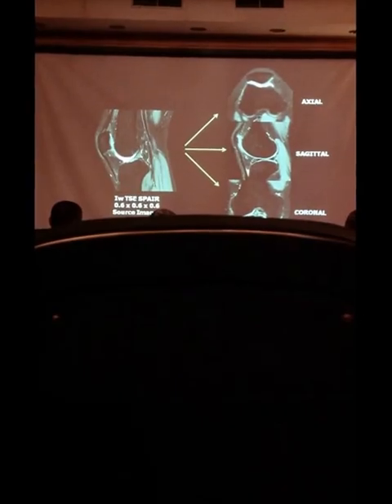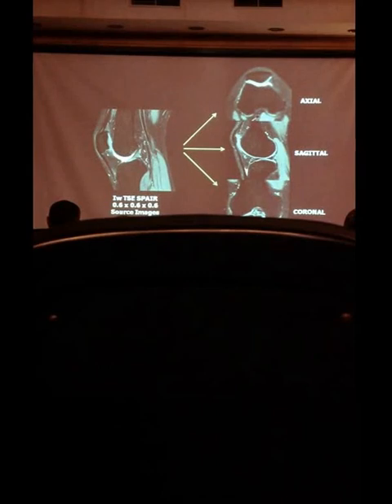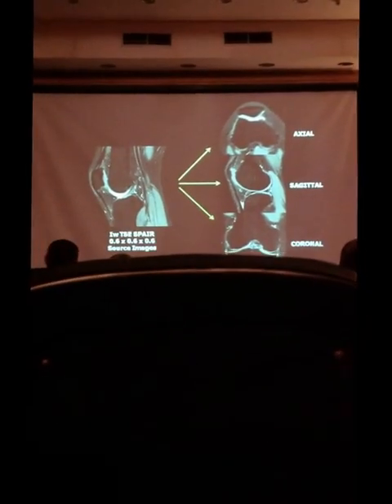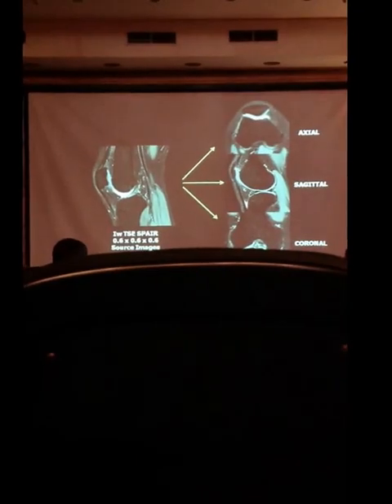If you want obliques, you can do it. You can do whatever you want. And this is fast spin echo contrast, which is great. So this has a huge potential to replace routine sequences, and this will be faster. We acquired that sequence in a 1.5 Tesla magnet within 5 minutes.